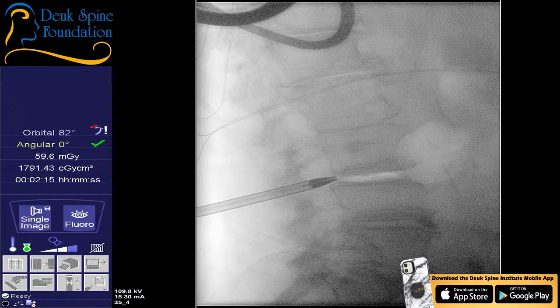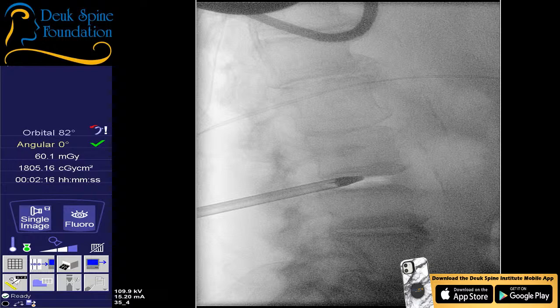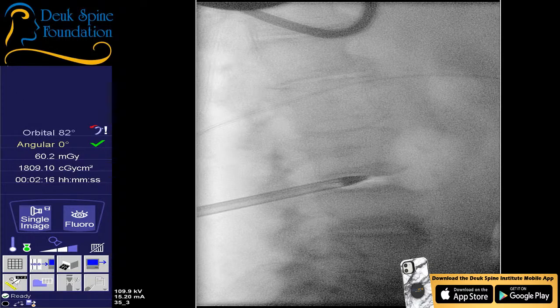Not really. It's definitely opening the disc up. Yeah, it went in. That's for sure. Let me see. Very tight though, but we're in. Let me do a little, yeah. We're not going to have the blue dye to guide us, but we're definitely in. I got it. Thank you, Luis. We need probably about 10 minutes, we'll be done.